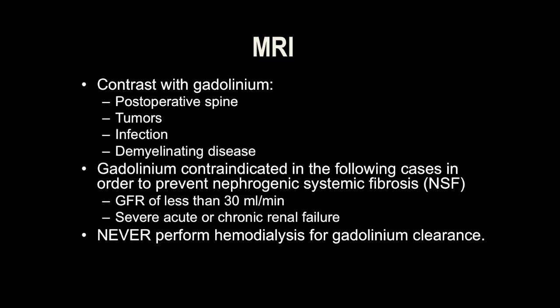Here we have cases in which we perform MRI with contrast. Indications include: the post-operative spine, when suspecting tumors or cancer involvement, when considering infection, and demyelinating disease. Our contrast agent is gadolinium.